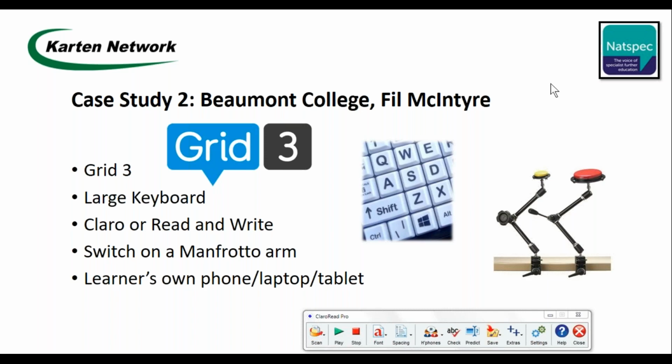And you can create one resource, and then different users can access it with their own preset accessibility. So if someone was an eye gaze user, that would be set into their profile, and you wouldn't have to change that every time you open that resource. They would just jump straight into it.